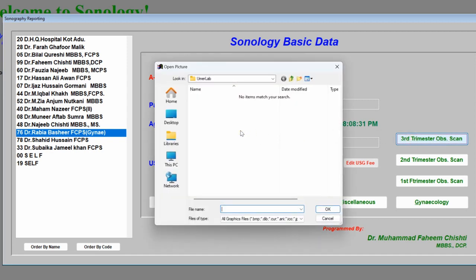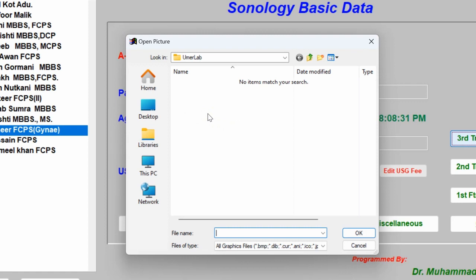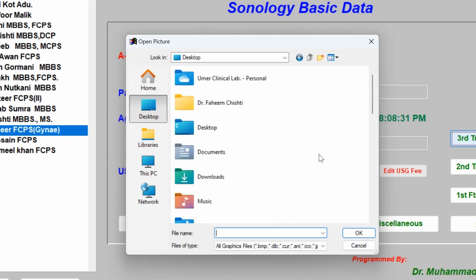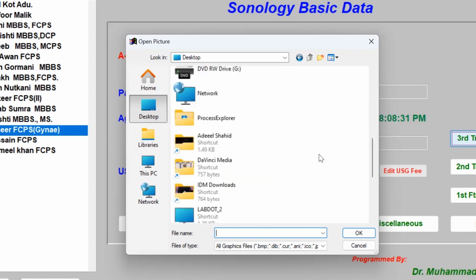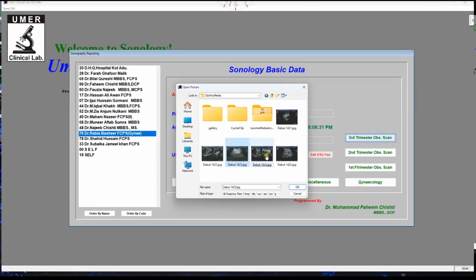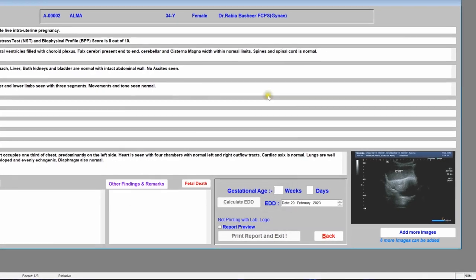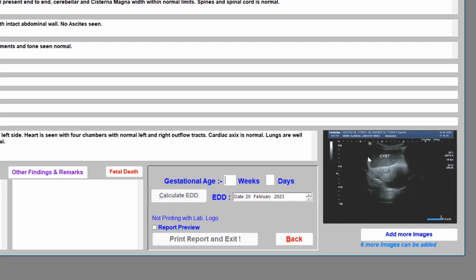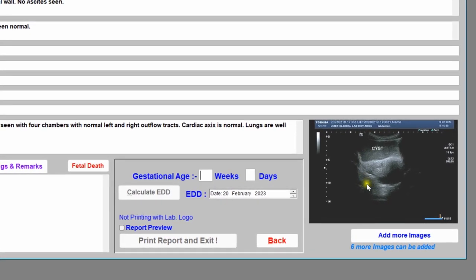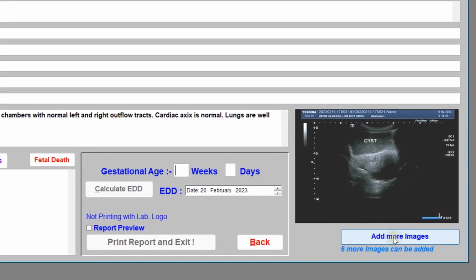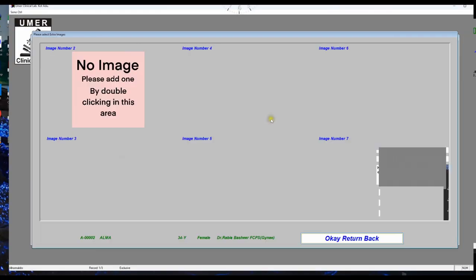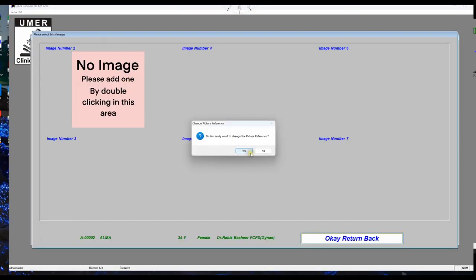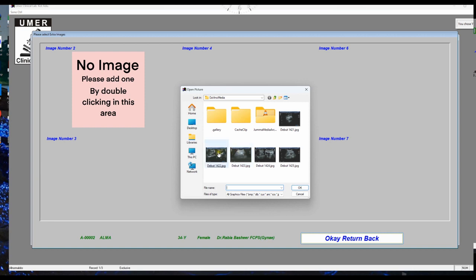Now it will ask you to add an image of the ultrasound that you have captured on your PC. Please select the image — suppose my images are in this folder. Select the image. This can be any image. You can add more images by clicking this 'Add More Images' button.